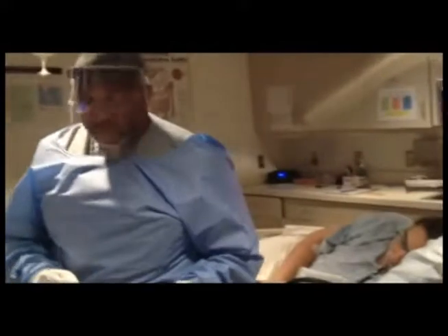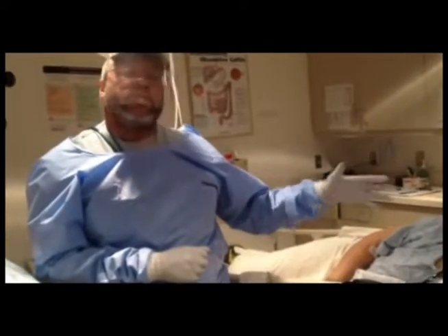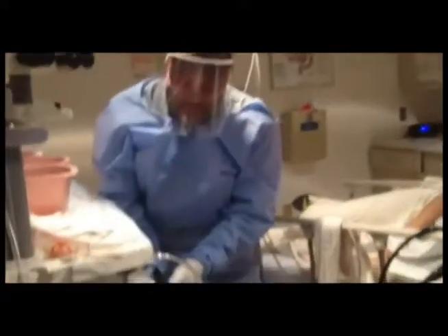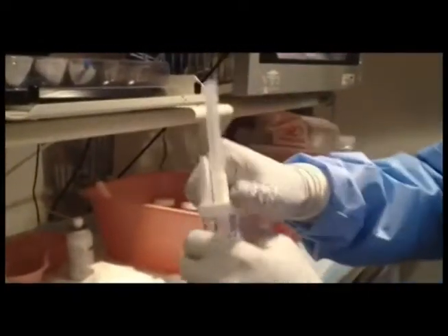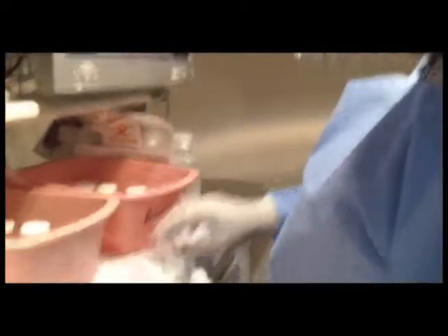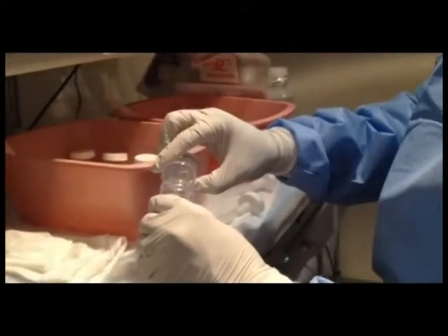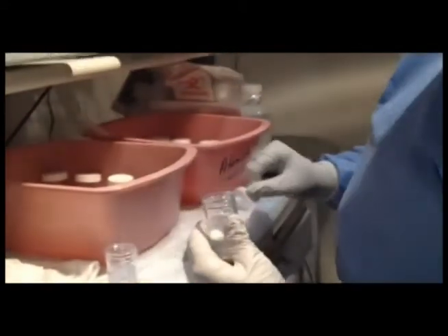That's the end of the collection for the 45-minute sample. I just rest the scope here; the patient is comfortable. We're given boluses of fentanyl and Versed, and our studies show that fentanyl and Versed do not impact the bicarbonate concentration that much. We'll detach the specimen trap — you can see there's a large amount of fluid, about 40 to 50 cc's. This particular sample will be split up for routine laboratory analysis, proteomics, and electrolyte measurements, with the remainder sent for proteomic analysis.